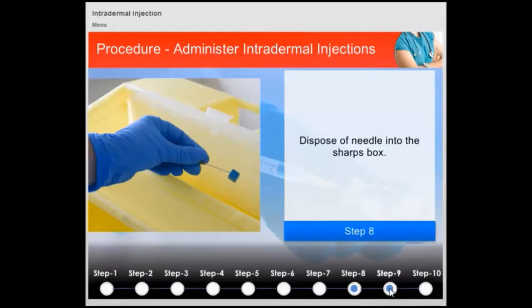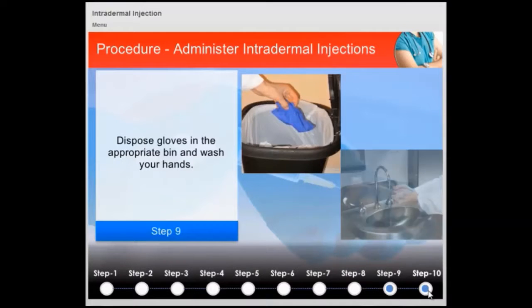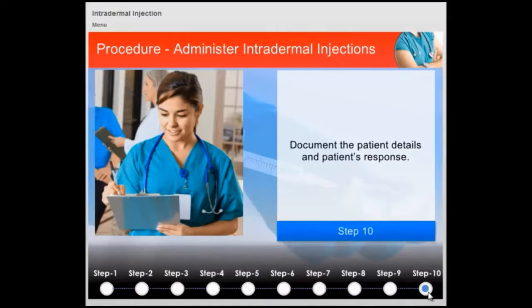8. Dispose of the needle into the sharps box. 9. Dispose the gloves in the appropriate bin and wash your hands. 10. Document the patient details and patient's response.